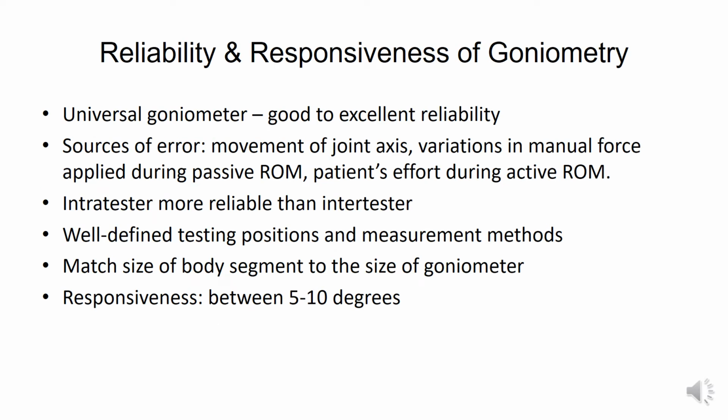Let's make a start with the reliability and responsiveness of goniometry. For reliability, universal goniometers usually have good to excellent reliability. This is despite it being a simple to use and non-expensive way of measuring joint range. As with any tools, there are several sources of error that may contribute to its unreliability.